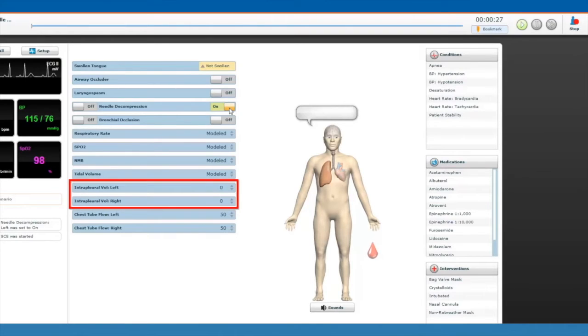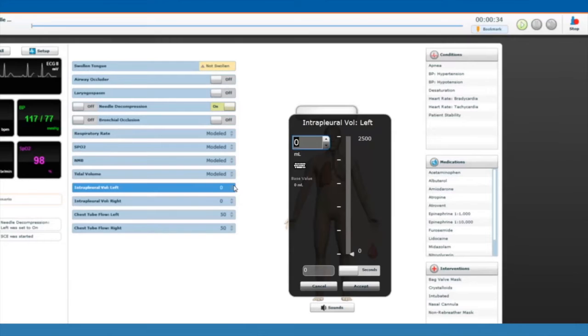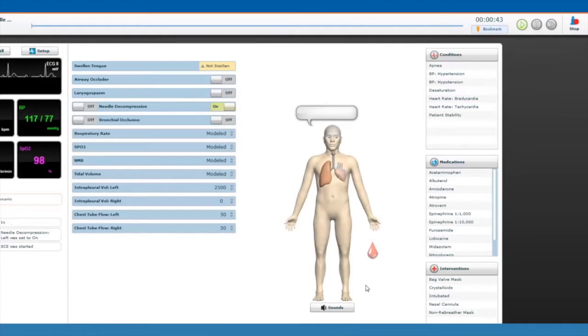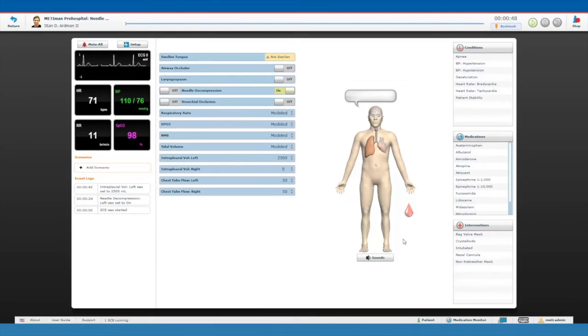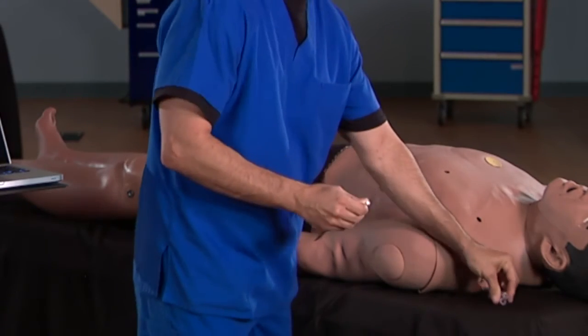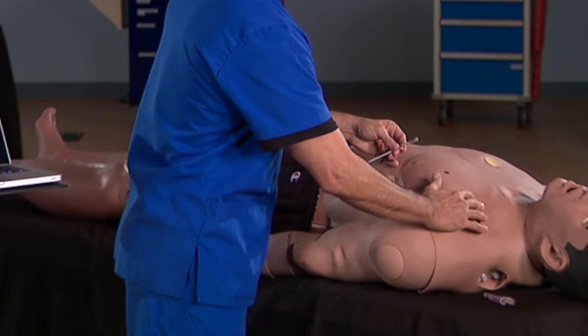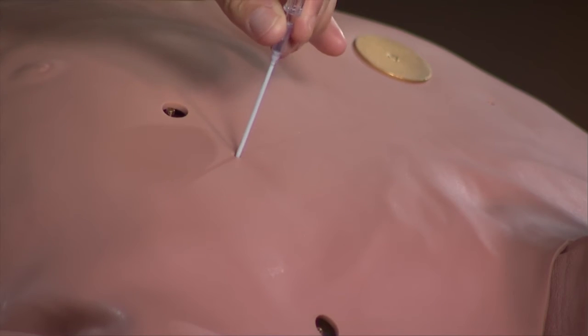Use the intrapleural volume parameter to allow intrapleural volume to accumulate. To perform needle decompression, insert the 14-gauge needle into the chest hole until you can hear hissing. Effective needle decompression immediately reduces the intrapleural volume.